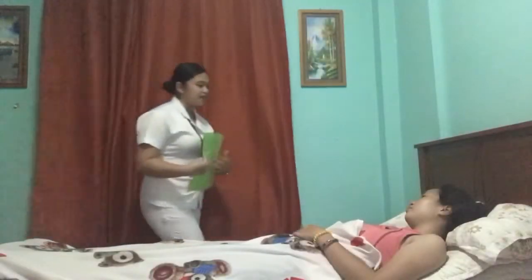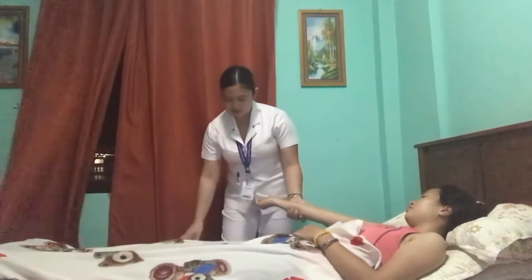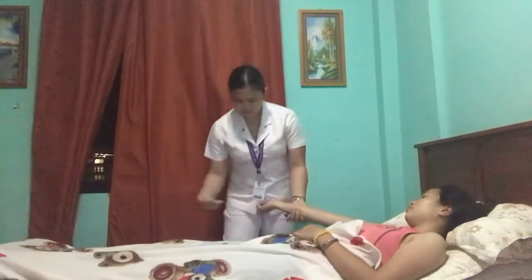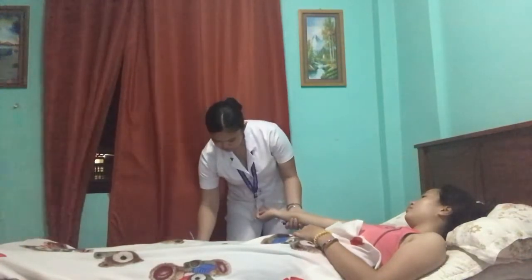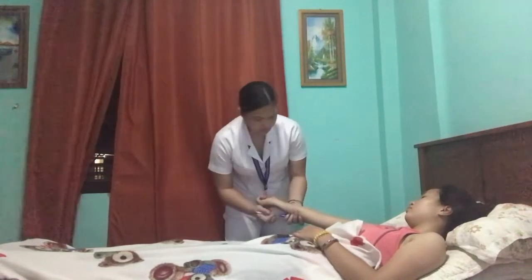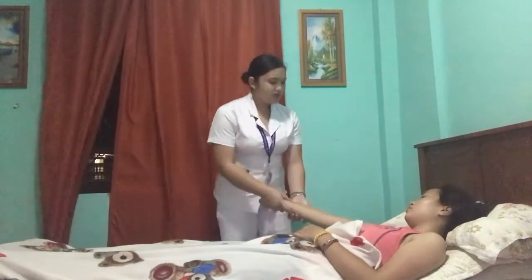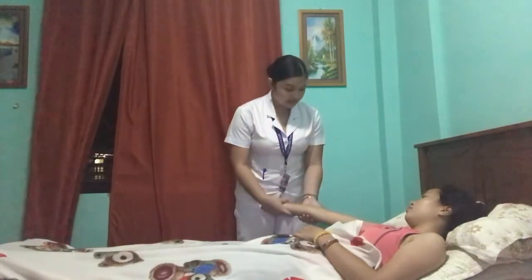So, how's your hand, ma'am? May I see your hand, please? So, let's document it first. As I can see, there's no red mark here. That means you don't have any allergies, which is good.